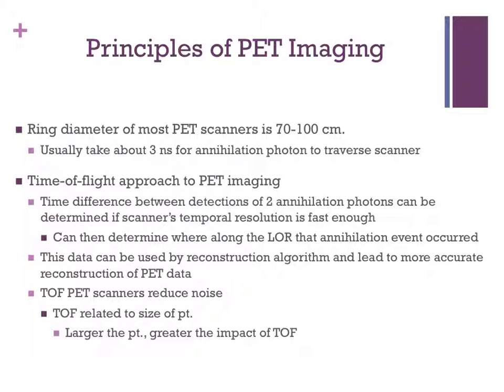Time of flight PET scanners reduce noise in the images, and the improvement is related to the size of the patient. The larger the patient, the greater the impact of the time of flight. All of the major vendors that market PET CT scanners also provide time of flight as an option.